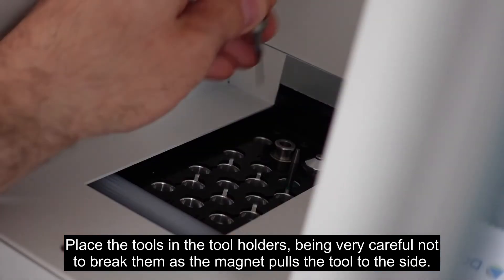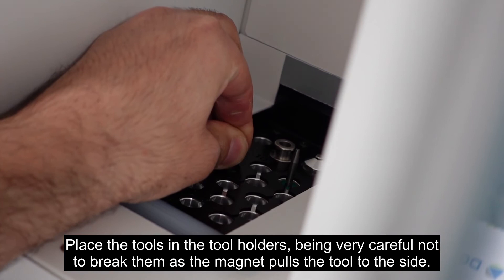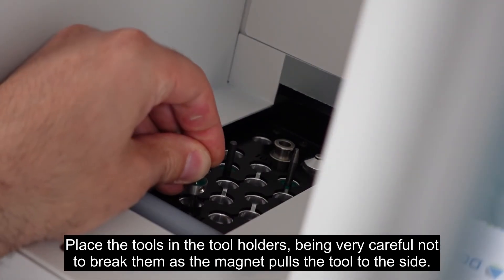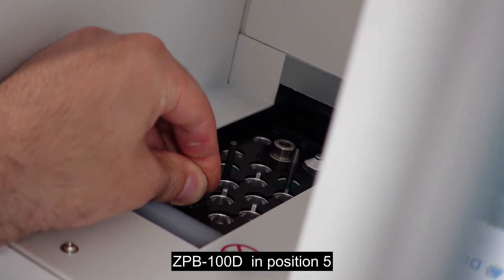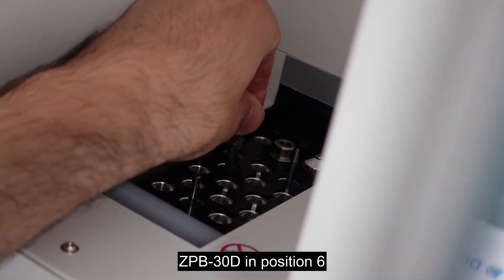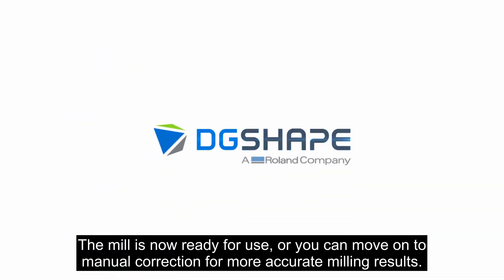Place the tools in the tool holders, being very careful not to break them as the magnet pulls the tool to the side. ZPB-100D in position 5, ZPB-50D in position 4, ZPB-30D in position 6. The miller is now ready for use, or you can move on to manual correction for more accurate milling results.